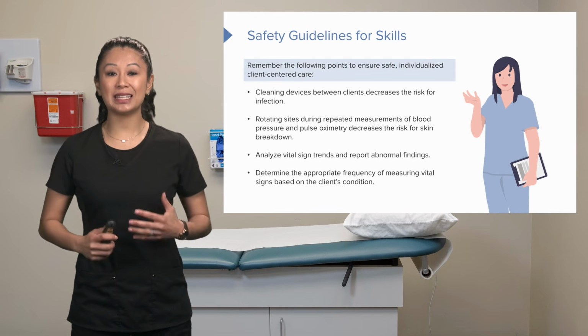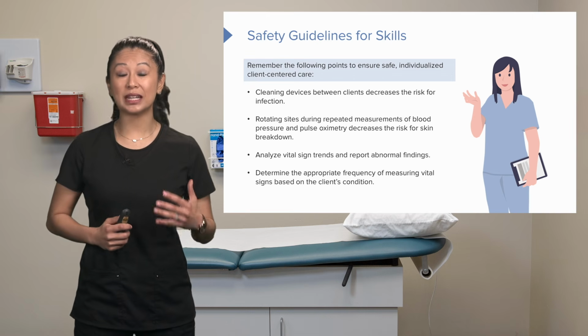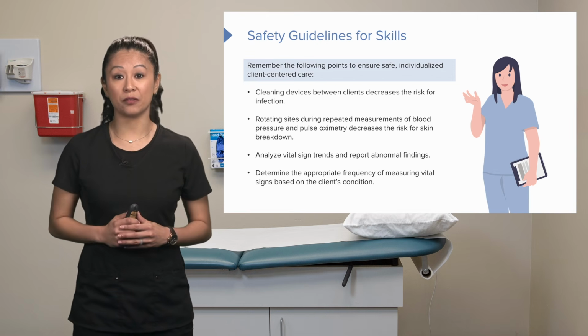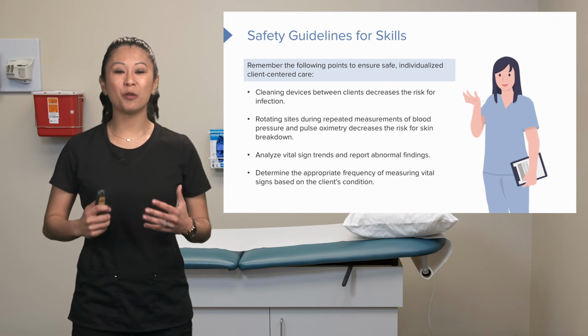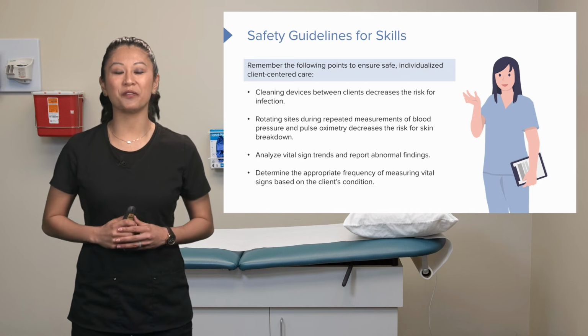If a patient's in the intensive care unit, for example, many times the patient's pretty ill, so we may have to do these vital signs very frequently, for example. Much more frequently than maybe a patient on a medical surgical unit. However, many times you're going to have a physician order for that that's appropriate for your patient.